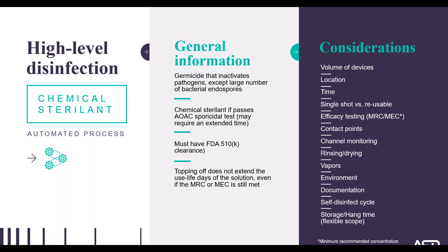What needed documentation is being captured on the printout? And if it's not being captured, do you have a way to capture it? Is there a self-disinfect cycle, either thermal, meaning using hot water, or chemical, available to prevent any biofilm formation in the internal components of the AER?